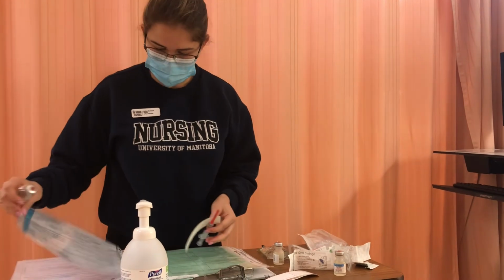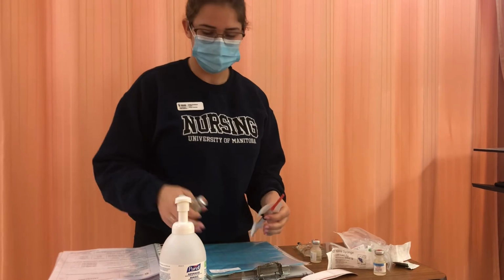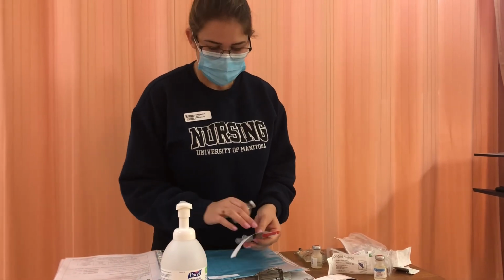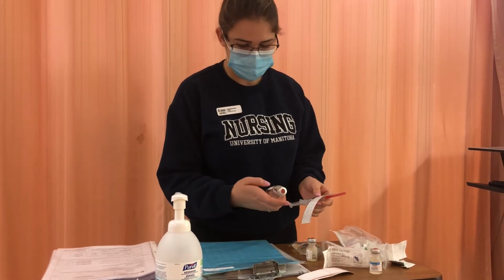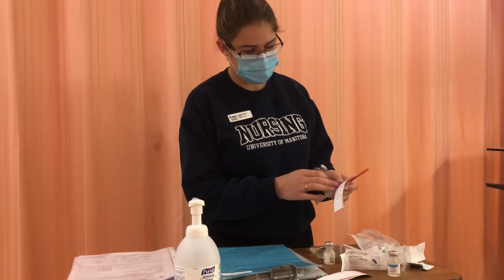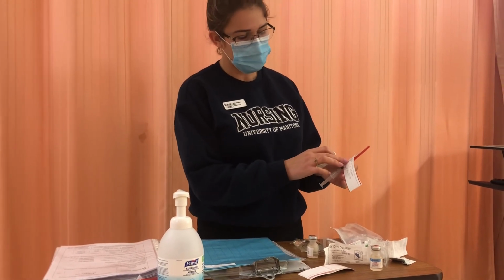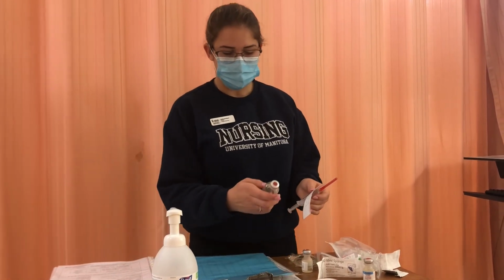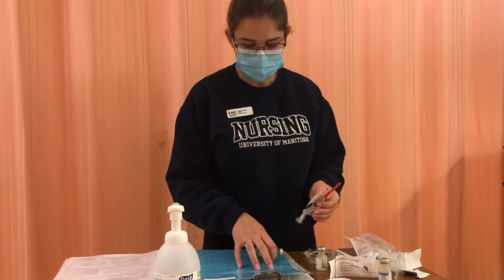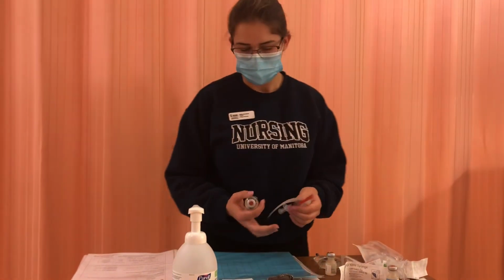So on my MAR, this is my MAR. I'm just going to redo my second med check just because I was doing it with my physician's order, which is still right. But Emma Wrightson, cloxacillin, 750 milligrams. 750 milligrams here because once I reconstituted it, the 2,000 milligrams, it was 250 milligrams per ml. I drew up 3 mLs and got my dose of 750 milligrams, so that's the right dose. It says IV on the bottle, and it's IV. We're going to administer IV to be given every 4 hours. So one of my time slots is 1,200 hours. It's currently 1,200 hours, so we're going to give this drug now. So that's my second med check.